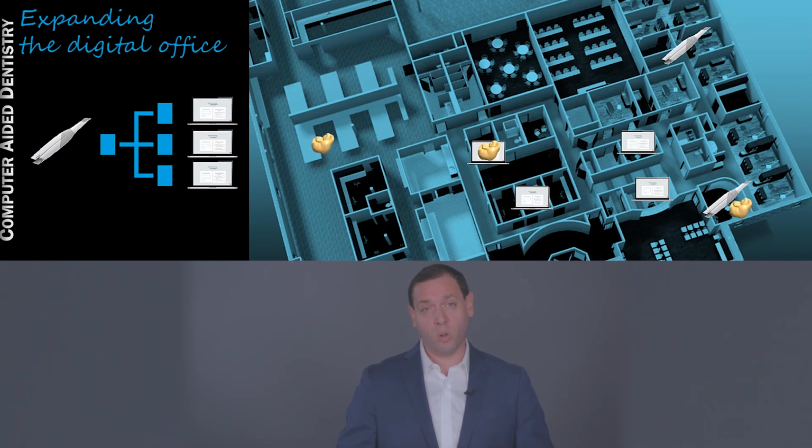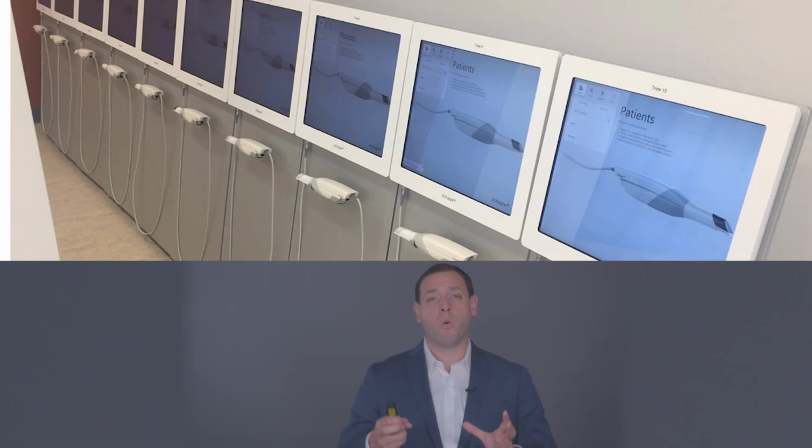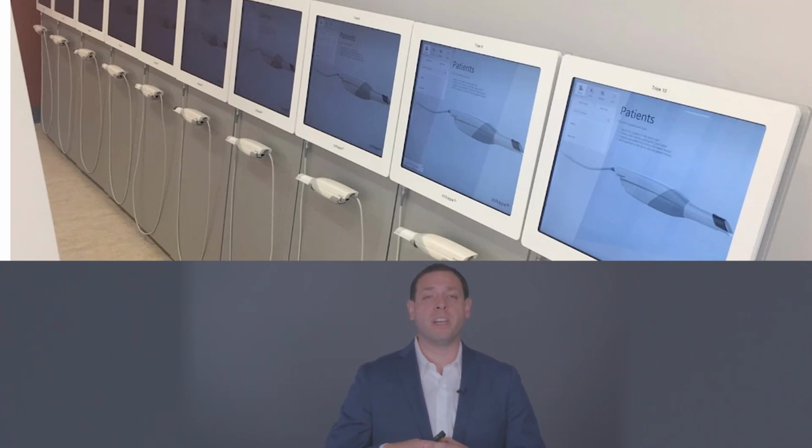But ultimately, our goal is to have a centralized area where all our scans are kept, and those are available on any of the computers within our office. It's an incredibly important concept. And being involved with Touro College of Dental Medicine, one of the first new dental schools in New York State in 50 years, where I'm the director of digital dentistry, we've had the ability to take these systems so that the students can gain practical experience and education within digital dentistry. But we have to take this digital ecosystem and expand it to up to 400 students.